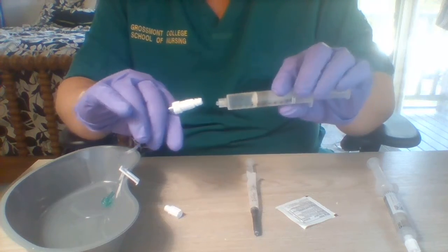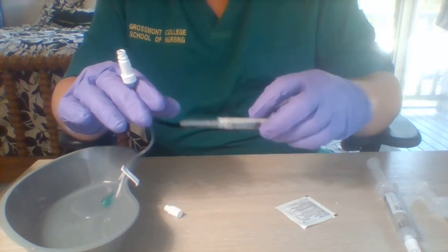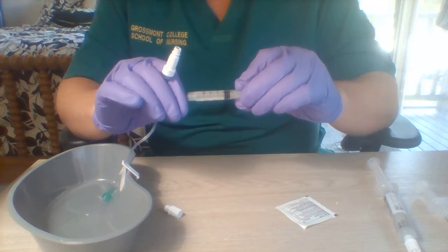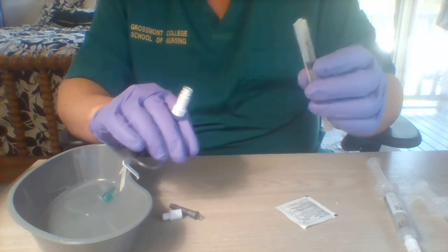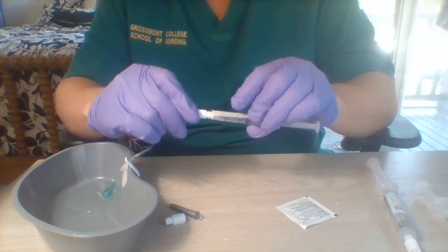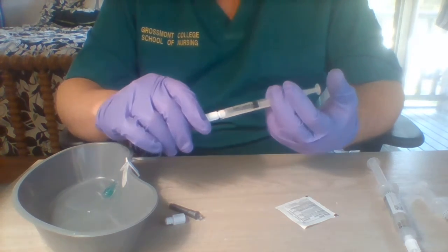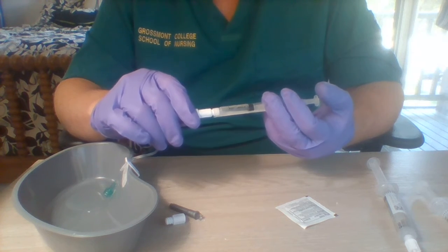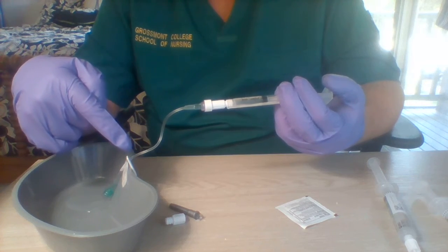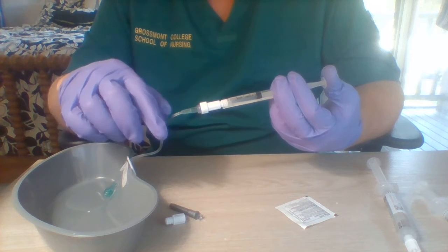And this whole time I'm making sure not to touch the end of the port or the ends of the flushes or the end of the syringe. So now I'm ready to administer my medication. I will unscrew the cap and attach it to the port. And we're administering 0.5 mLs every 30 seconds. In the port here is 0.5 mLs. So the first time I need to administer 1 ml, which I will do now.